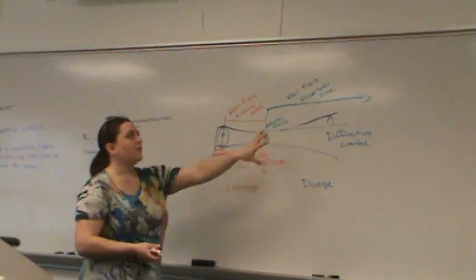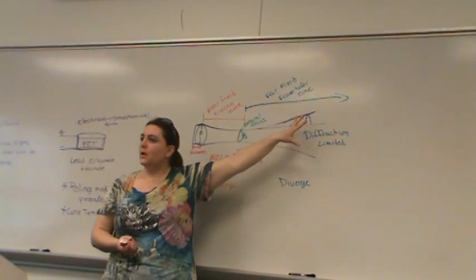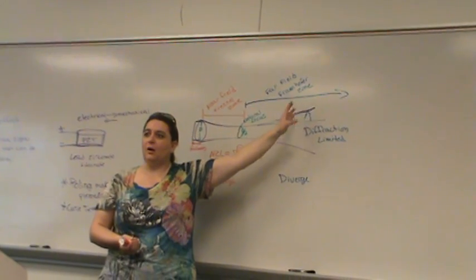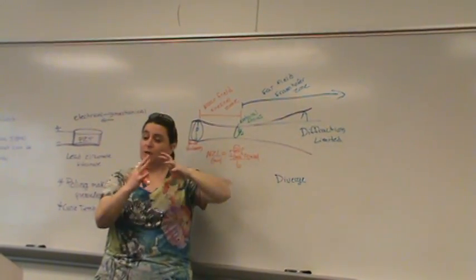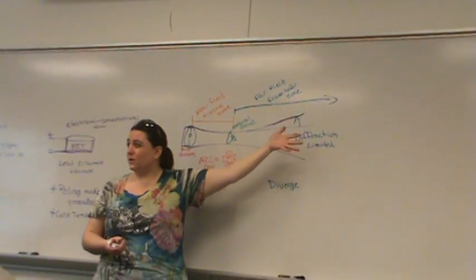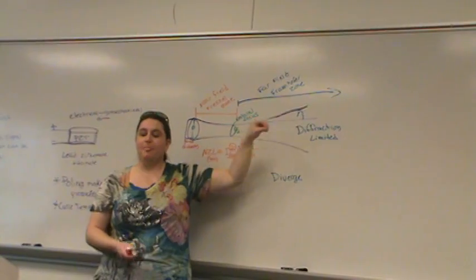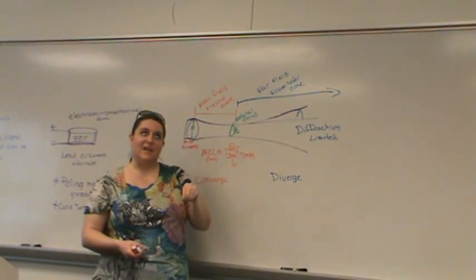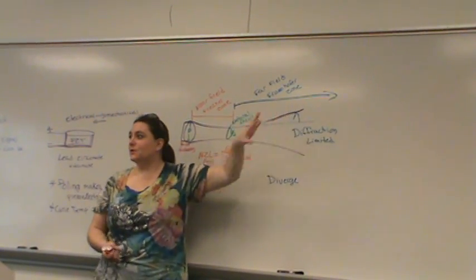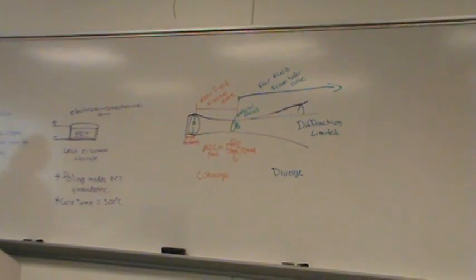And the reason the far field is diffraction limited is that the beam is starting to spread out there, and then we lose any resolution we had. And our far field signals, or our far field images, are often very fuzzy and don't have very good resolution because of this diffraction effect. Diffraction effect, there we go, that's happening out here. So that's why they use that term a lot, that the far field is diffraction limited.